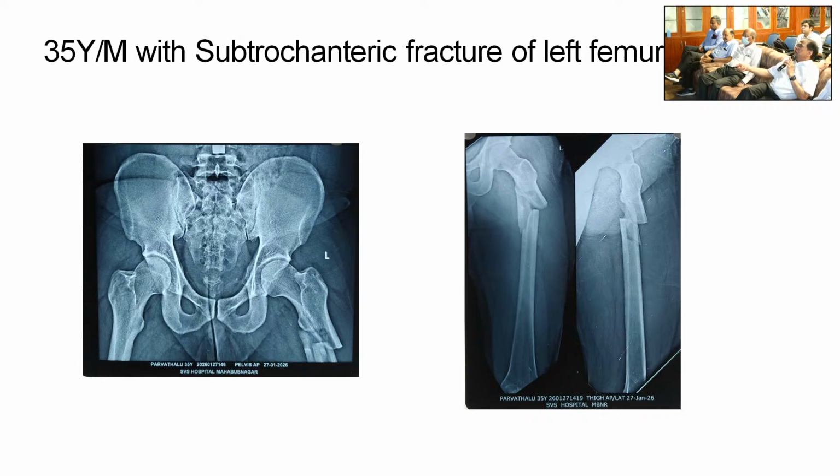And you end up like the nail we have done. I've seen most of the nails. Most of the time the entry point is not right. The entry point is the extension of the medullary canal, both in AP and lateral. Basic principle. Unless it's straight, because most of the nails are straight. So if it is not straight, it won't go in. It will hitch on the medial side or posterior side, and you break it most of the time. Okay, show me the next one.